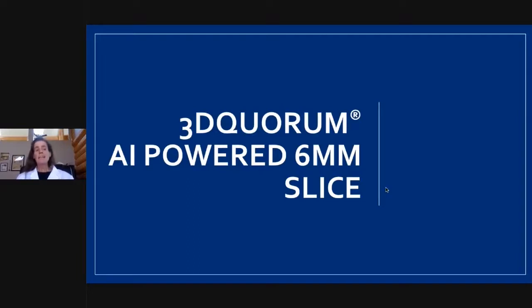And so then we decided to look pretty critically and say, are we missing anything? Are we calling something that maybe we're not seeing on both images? And so we did a study. We had each of us look at the images without the full field digital, just using the synthetic view, and then together, recognizing whether there were any lesions that we weren't seeing.